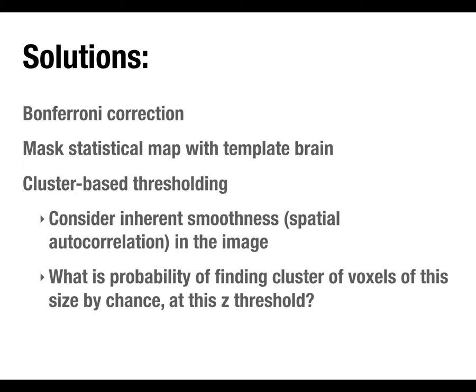But even with this, there have been, over time, some realization that initially even the defaults in the fMRI analysis software packages were overly liberal. And there were a series of papers that were published over the last few years demonstrating this. And there was a whole uproar, and for a while, the popular press was like, oh, fMRI is bogus, all these guys are just grossly inflating their claims, and we can't interpret anything, which isn't quite true.